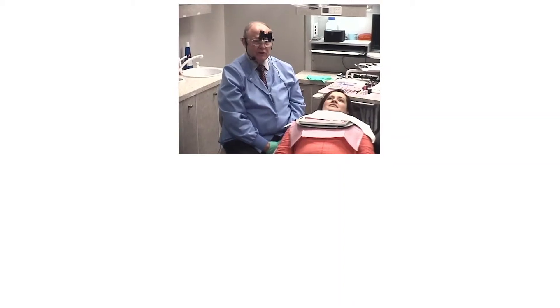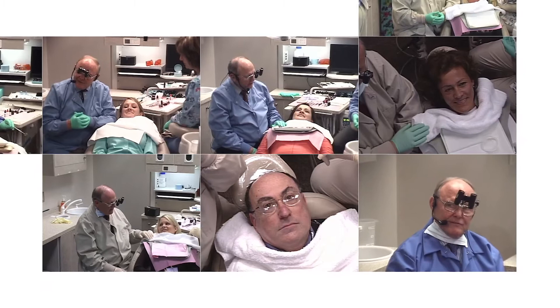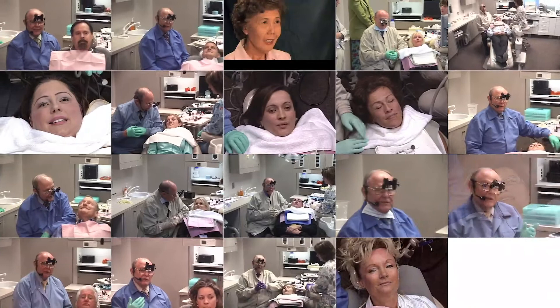Let's talk about our patient today. Our patient is a dentist, a young lady, a preeminent lecturer, a dental hygienist from Bulgaria, Buffalo New York, Atlanta, Oklahoma, Vancouver Canada, Boston, Kansas City, San Francisco, Montreal, Munich Germany, London, and Santa Maria California. Now we're going to place lumineers on our patient.